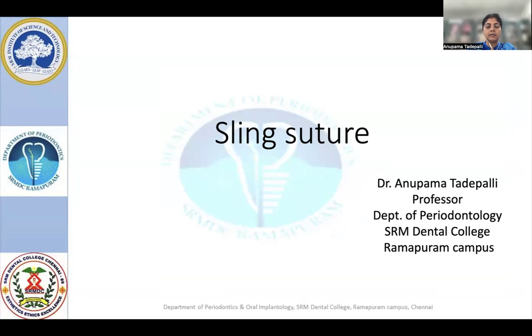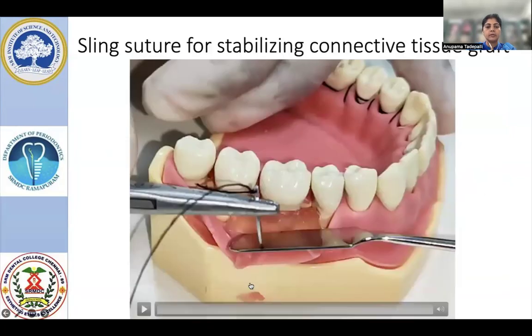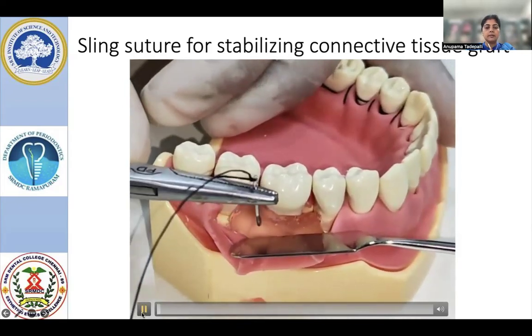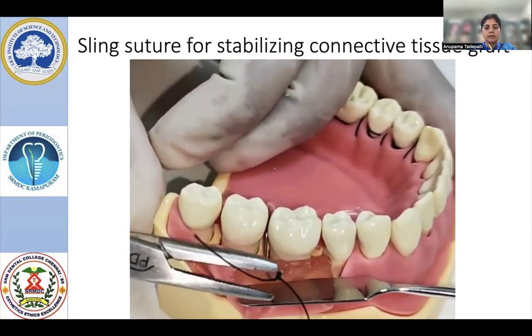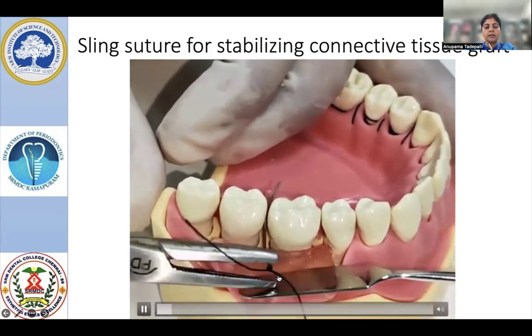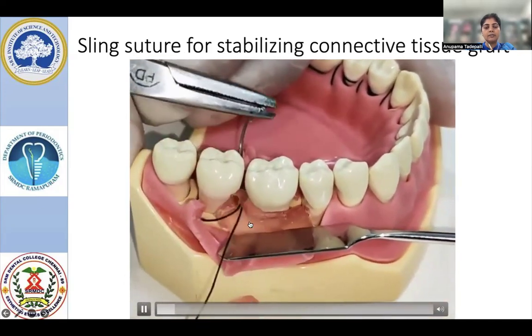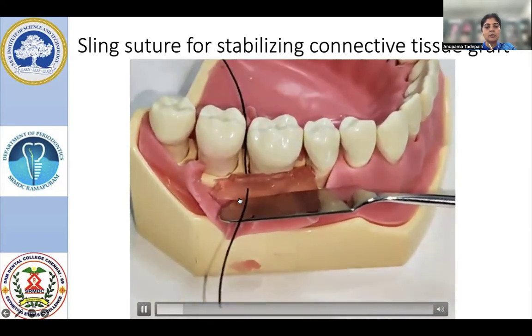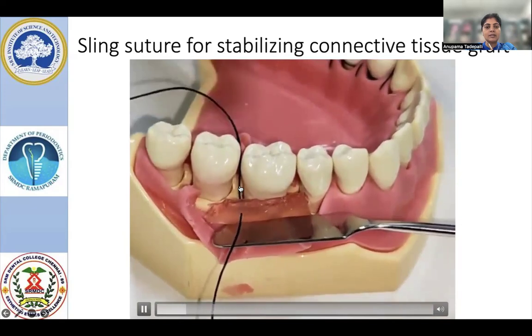We will move on to the clinical scenario. If you see this scenario, you are having a tissue that is mimicking connective tissue graft. The pink color tissue we have here mimics connective tissue grafts, and we will be seeing the suturing. Whenever you are doing a single tooth augmentation, you will be adapting the connective tissue graft onto the prepared root surface, and we need to well stabilize this connective tissue graft for better success.